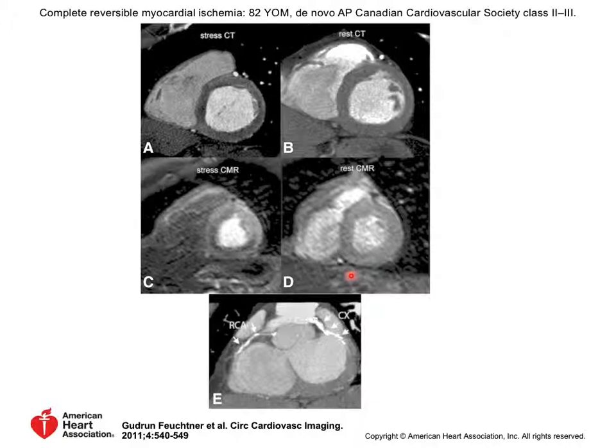Sometimes the physiology doesn't work. A person can have a relatively high-grade lesion upstream and still their stress test looks fairly normal. They just get around it. Their heart has figured out how to get around it. And so that is a cause of false negatives, right? If you're using this to detect a lesion that you want to treat and you miss it, then you've got a false negative on your hands. And so MR is pretty solid in terms of its sensitivity.